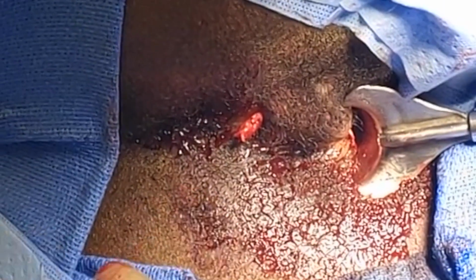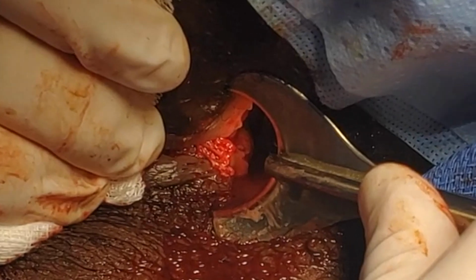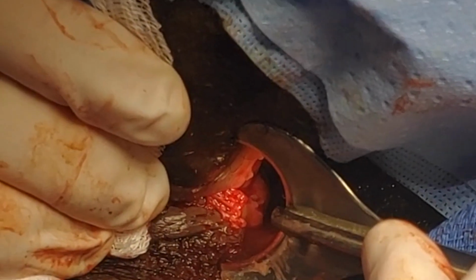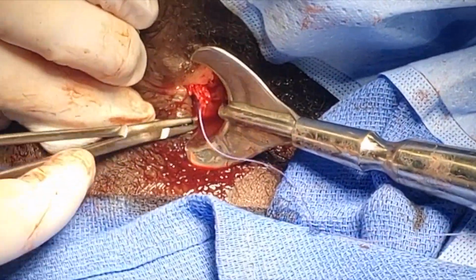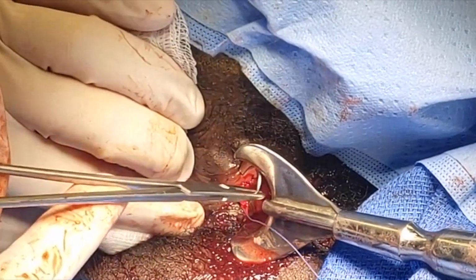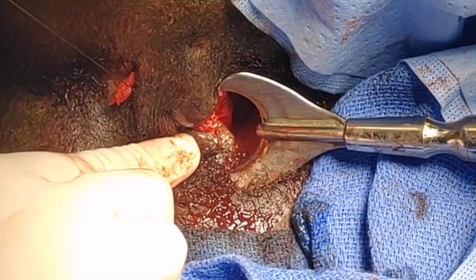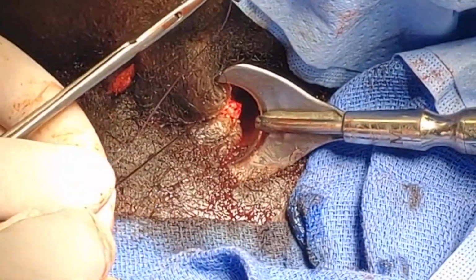The implant is now properly in place with 5 millimeters of overhang externally and internally, and now ready to be sutured in place. This is done by placing 2 Vicryl sutures in a figure of 8 manner through the anal wall and through the implant, thereby obliterating the internal opening. Generally, 2 or 3 figure of 8 sutures are required.